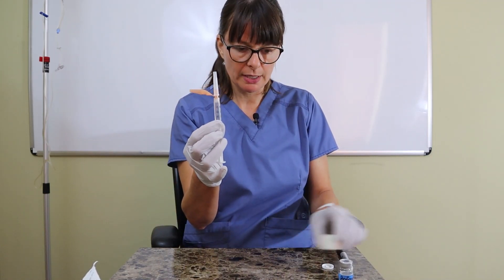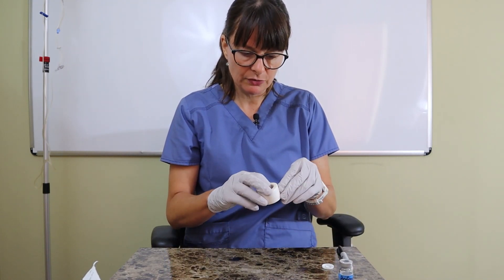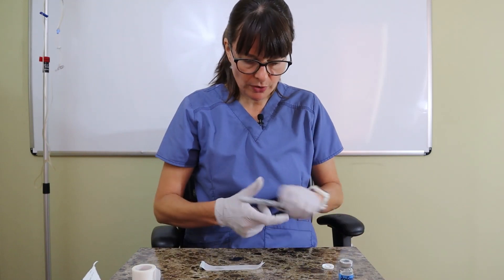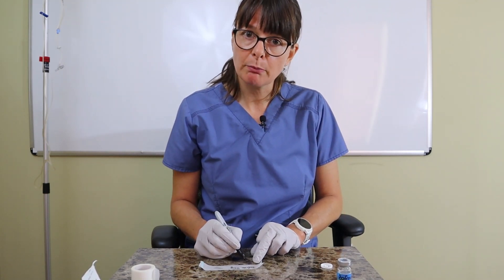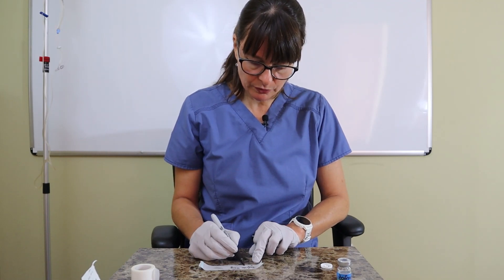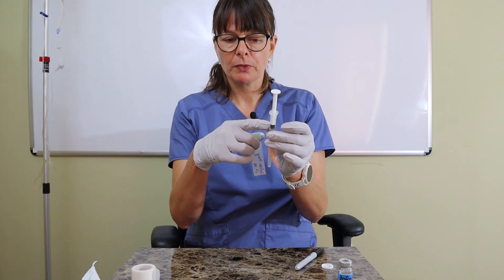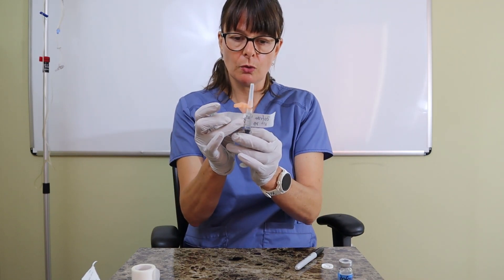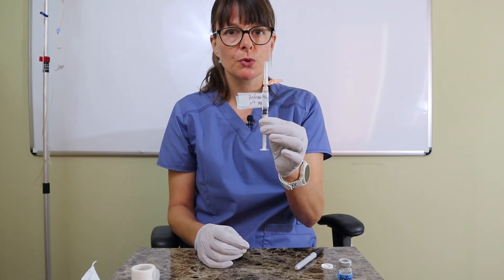Now I have my 4 mg of Zofran, and I'm ready to take it to my patient's room. But this liquid looks like any other liquid, so I'll use tape to label the syringe with what's in it — Zofran, 4 mg — and I could include the patient's name, date of birth, or medical record number. Always put the time and your initials so you know when it was prepared. Keep the tape away from the plunger so you can still see the volume, and make a little tab with it.